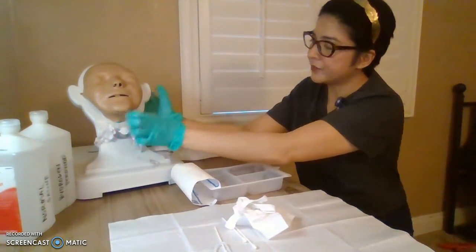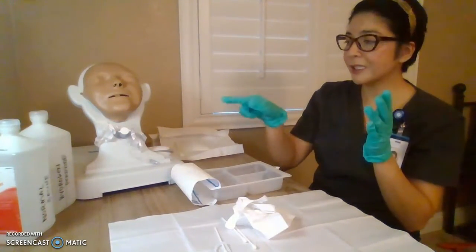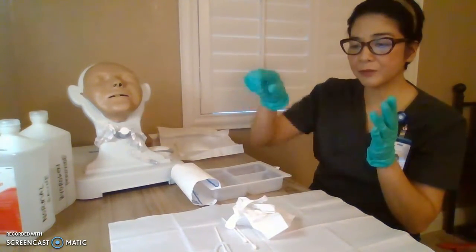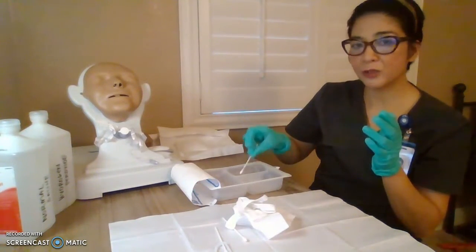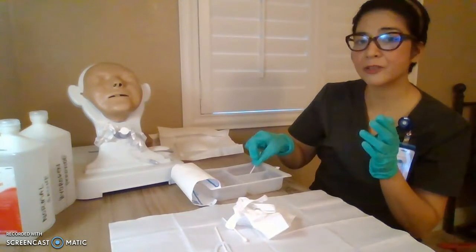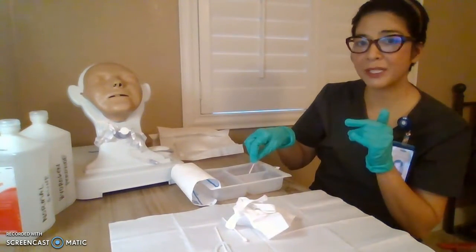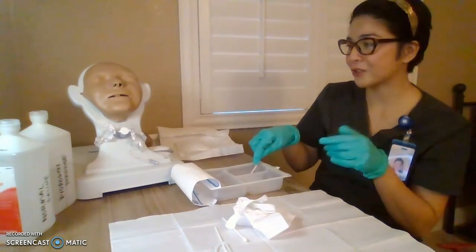There you go. Reinserted. All right. So now what we're going to do is clean around the stoma site. We're going to use our cotton buds right here, using the normal saline only. Again, not the one with the hydrogen peroxide. We don't want that on your patient's skin. Okay, so we're only using the normal saline solution.